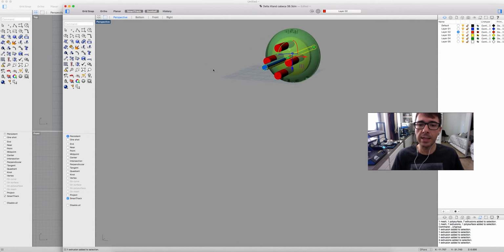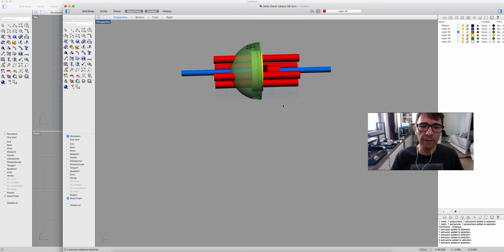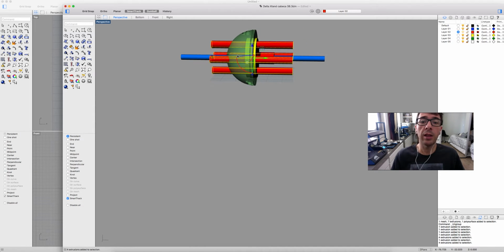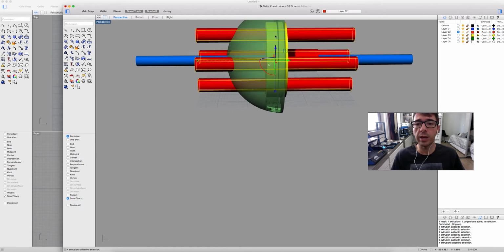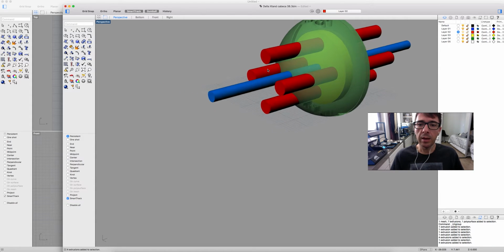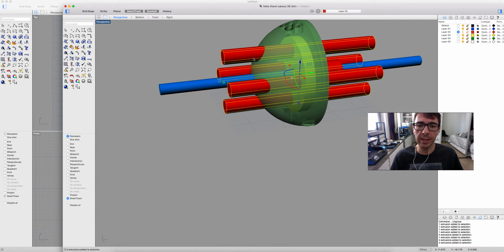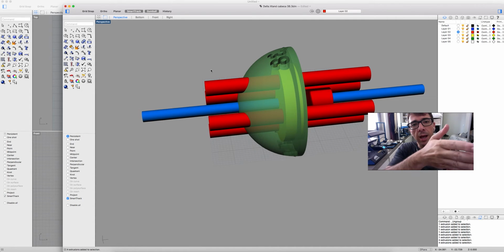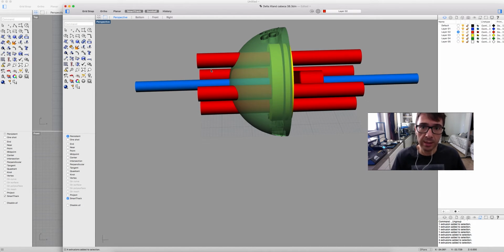When you see this design, you can see that we have created the screws. The cylinder screws do not start here in the base plate. We prolong them to the articular side because it's important to understand the direction of the screws. So it's important to understand how they go, how they are directed in surgery. This is important for the central pin guide.